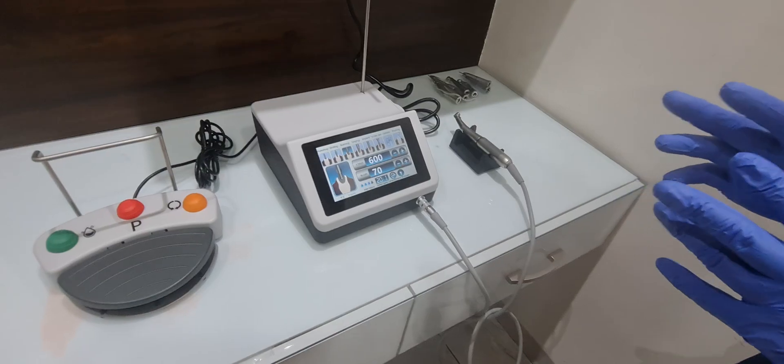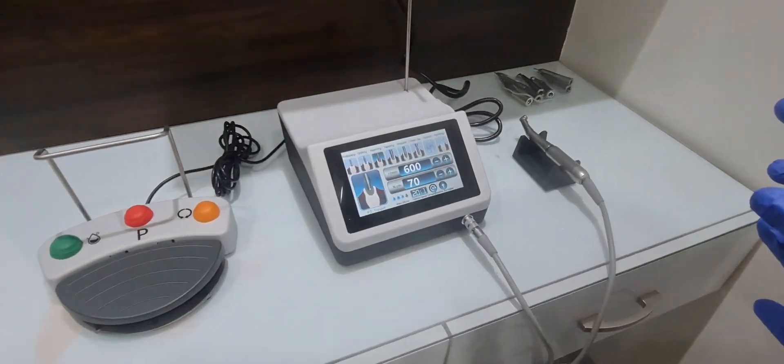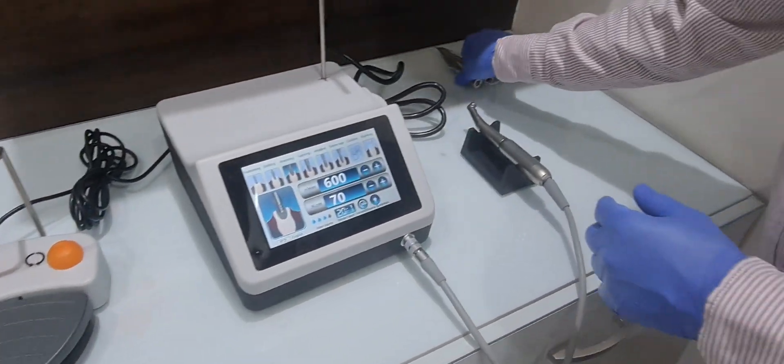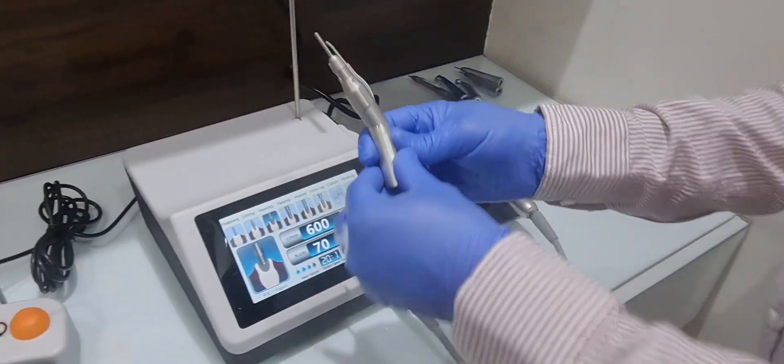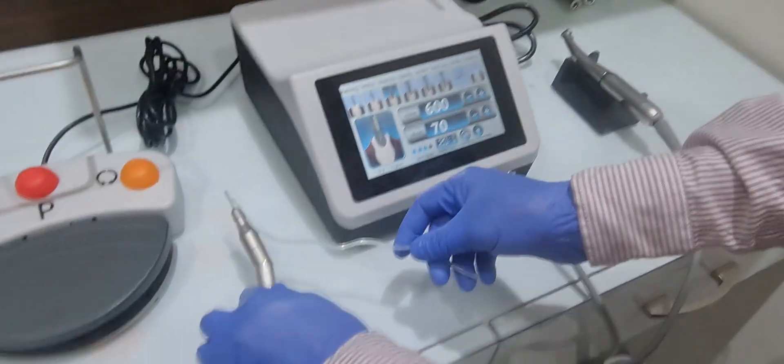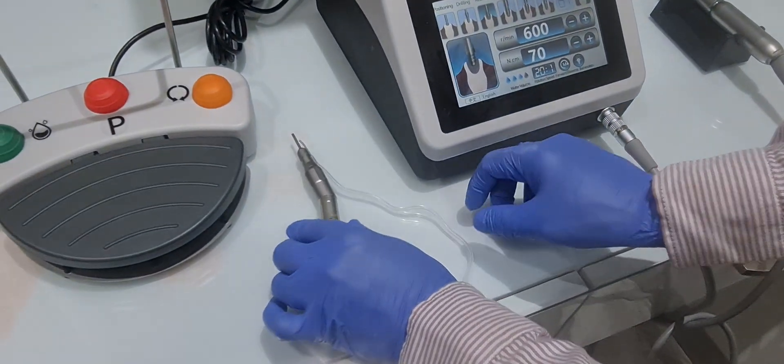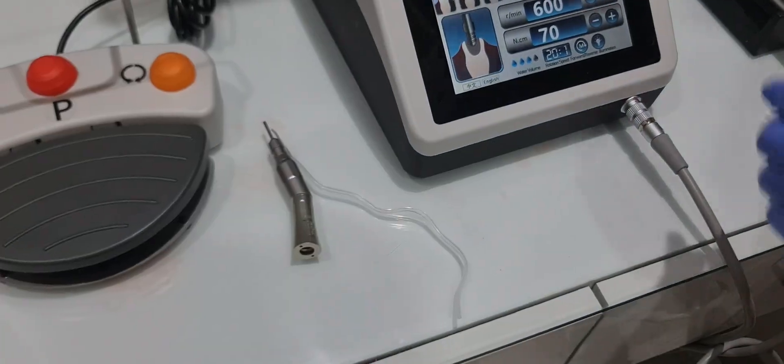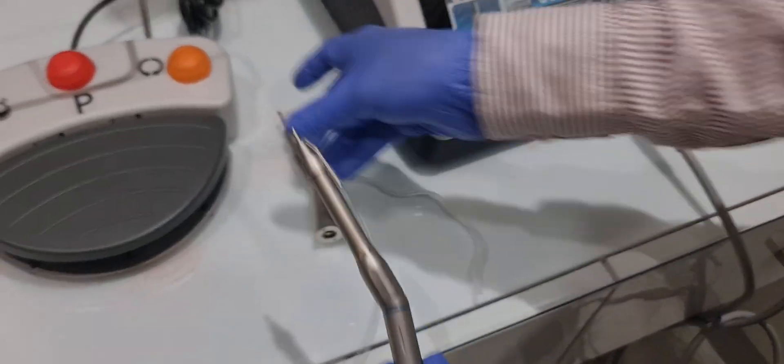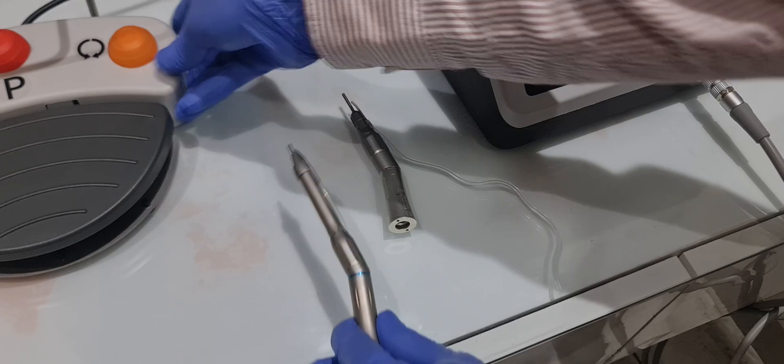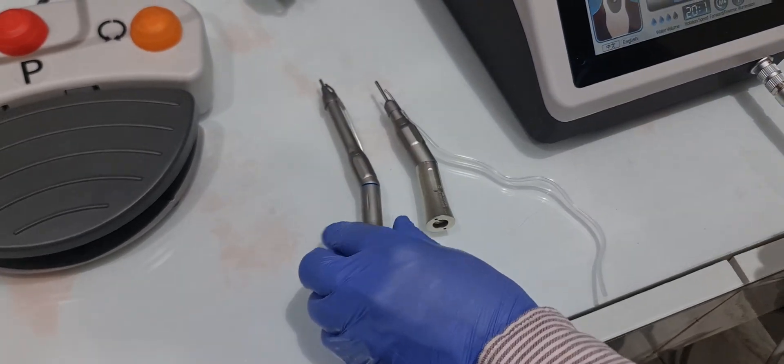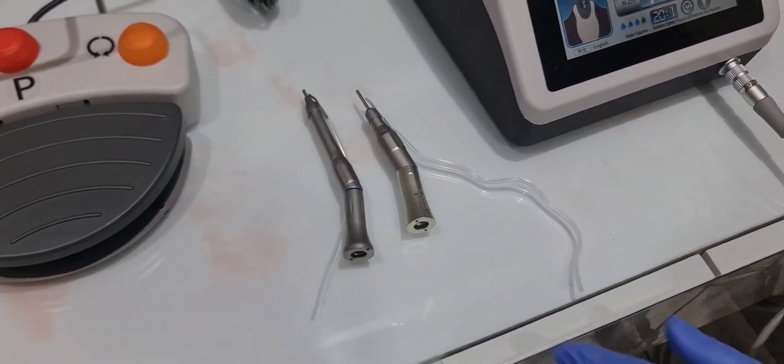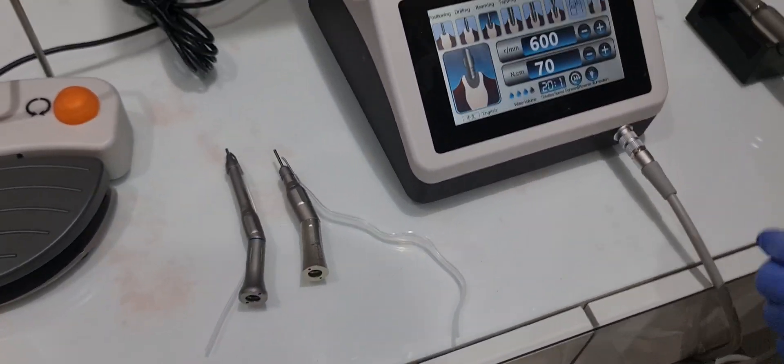I will show you the number of handpieces which can be attached to this. This is a straight surgical handpiece. And this is also a straight surgical angulated handpiece, the long one.